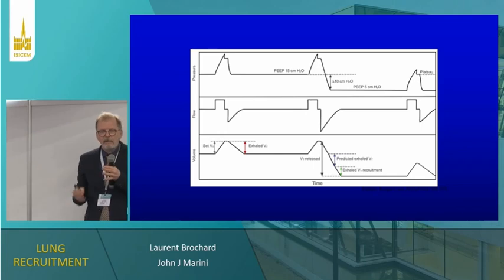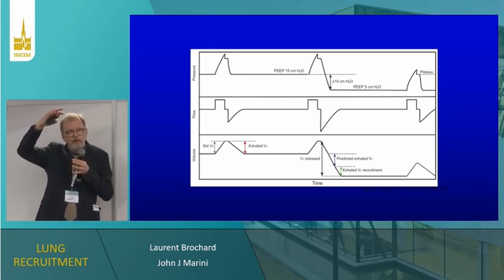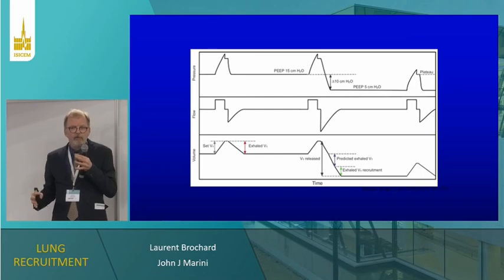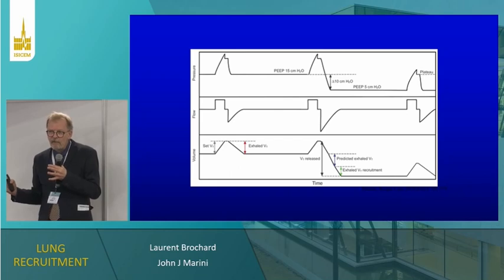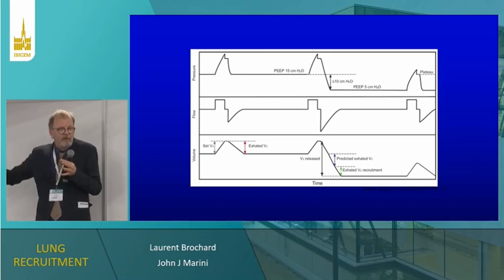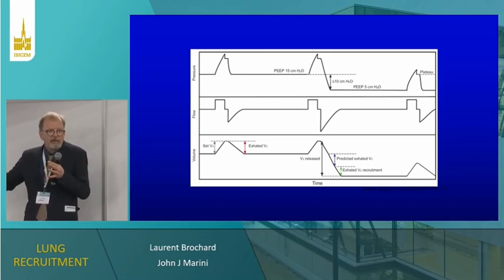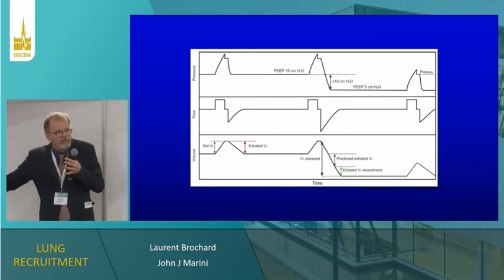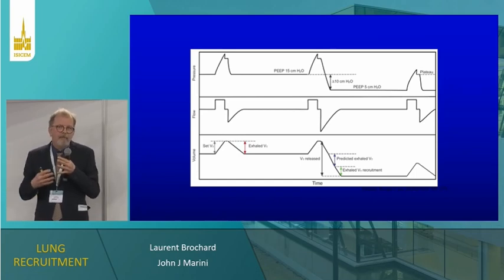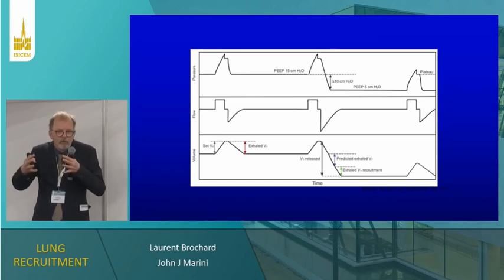30 times 10. So we say, okay, if we can measure the change in volume between two PEEP levels, and compare to what is predicted by compliance, we can say whether this difference in volume is purely explained by the inflation of the lung, that would be no recruitment at all, or there is additional volume, which is, let's say, a recruitment, right? Whether it's purely more units or it's a better mechanics of the lung does not matter too much in this regard. You have recruited the lung.